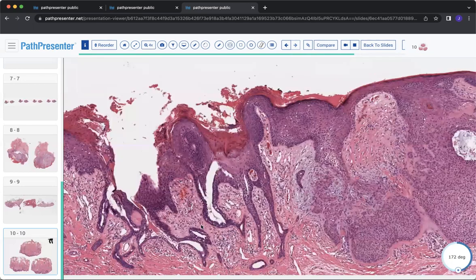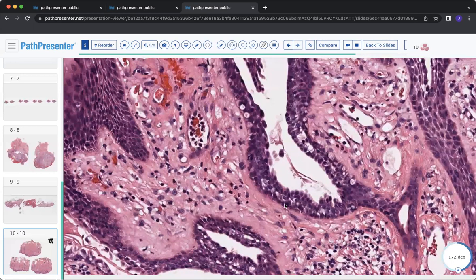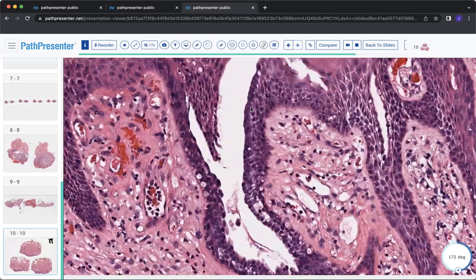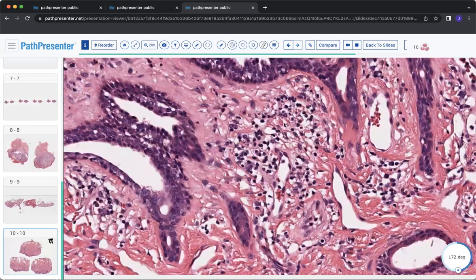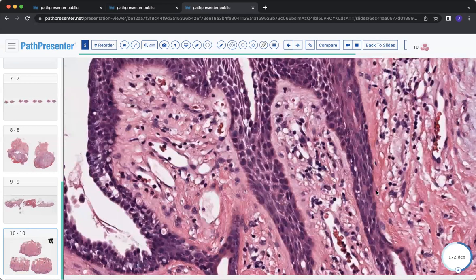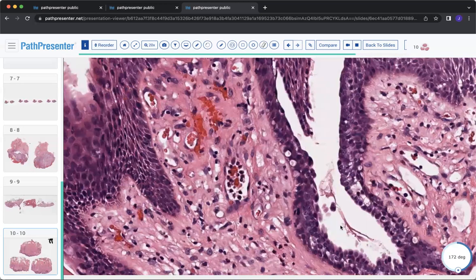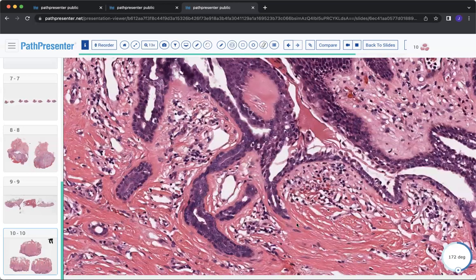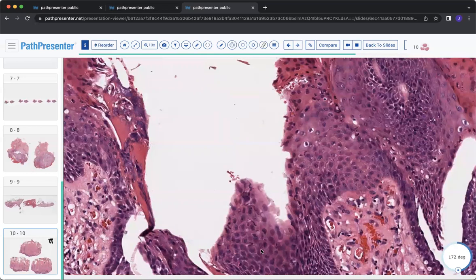But right next to it, you have almost a glandular appearing cell population. There's some apocrine differentiation here of these cells. You go on higher power, you might see more plasma cells within the cores of these fronds of projections lined by this apocrine ductal population. Just giving you another view of this, and it opens to the surface, the exterior surface here.